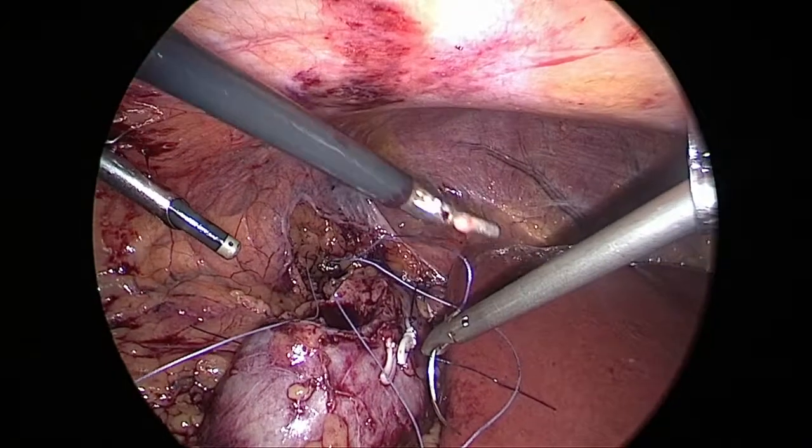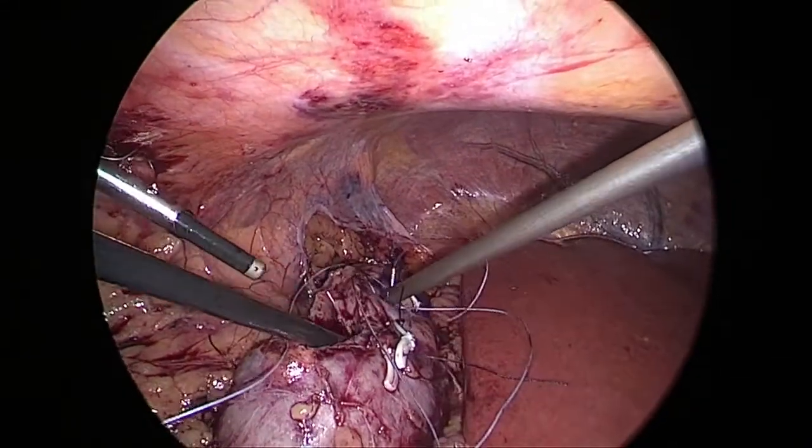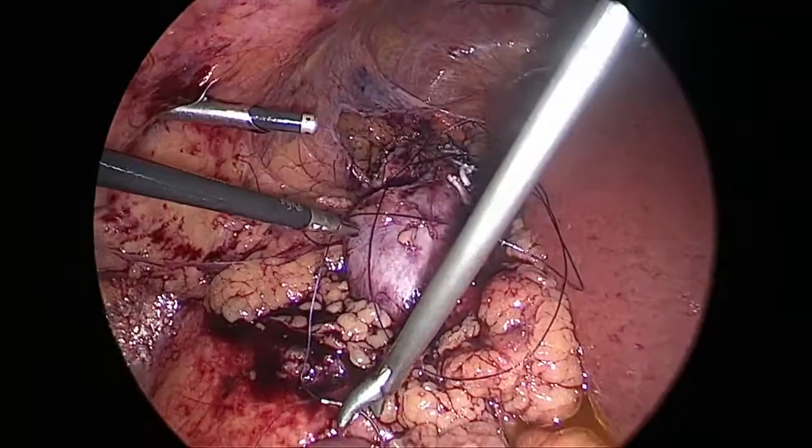The first layer of renorrhaphy is completed. Now I will do the second layer to oppose the margin of the kidney.